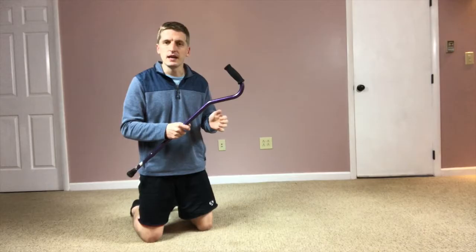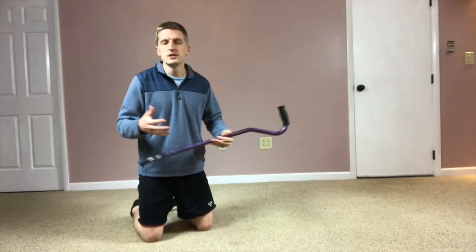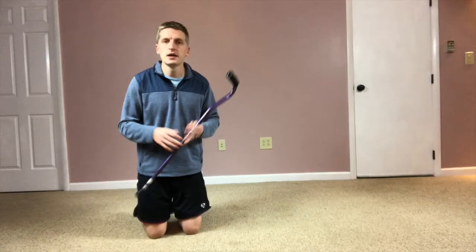If you do start with a walker, you'll probably, within a week or shortly after that, transition to using a cane, and hopefully eventually transition to using no assistive device, especially if you didn't use a device before surgery. That's a very reasonable and achievable goal. So let's talk about how to use a cane appropriately, safely, effectively, after knee replacement surgery.